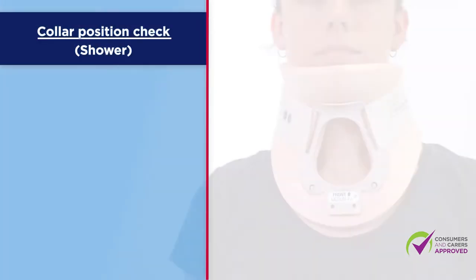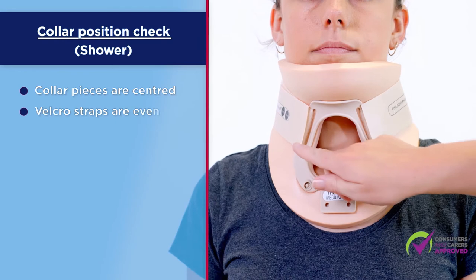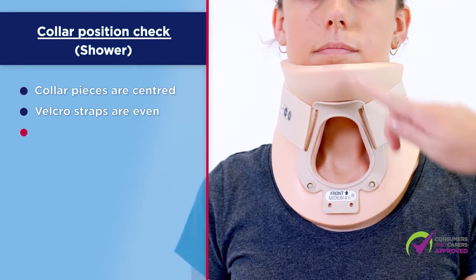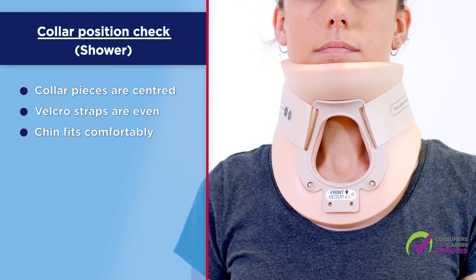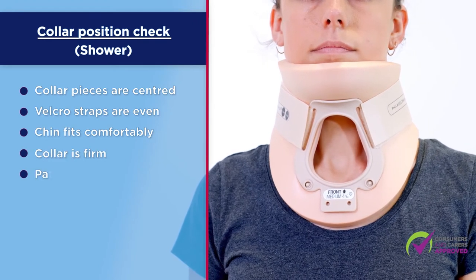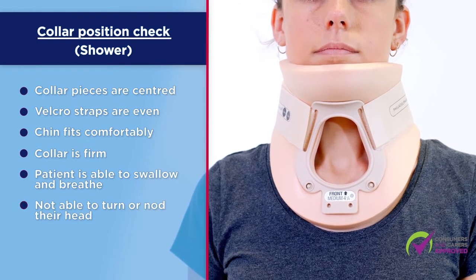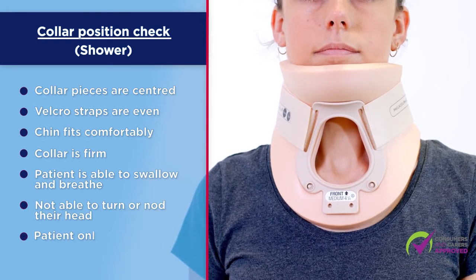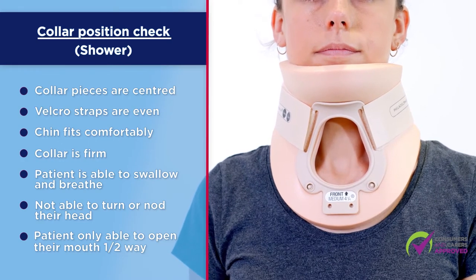Check that the collar is correctly positioned. The collar pieces are centred. The Velcro straps are roughly even. The chin fits comfortably into the chin section of the front piece. The collar is firm. The patient should be able to swallow and breathe, but not turn or nod their head. The patient should only be able to open their mouth halfway before feeling pressure on their chin from the collar.